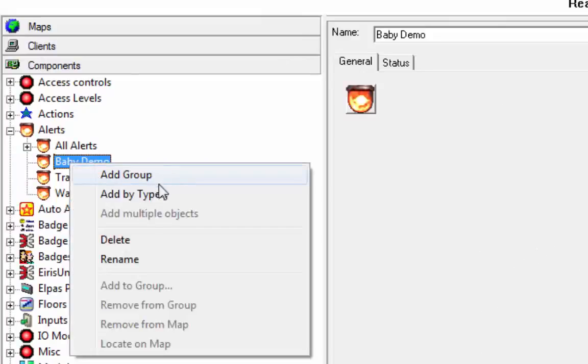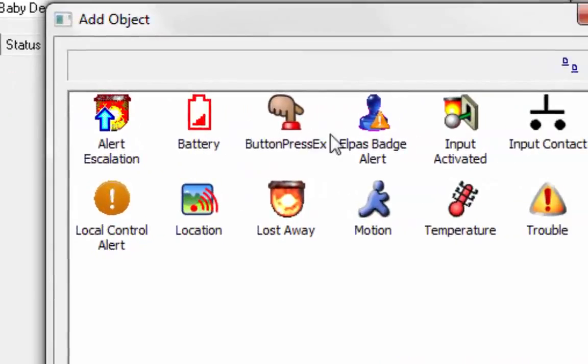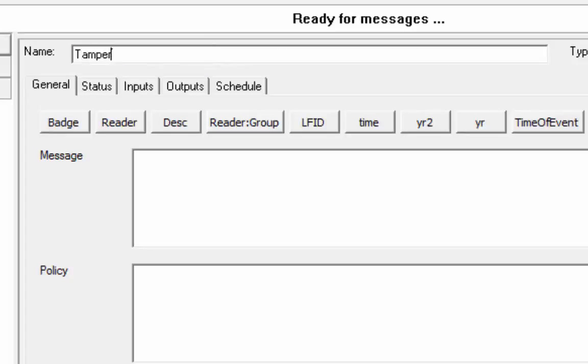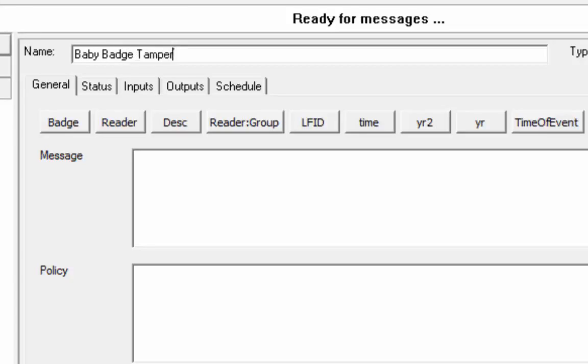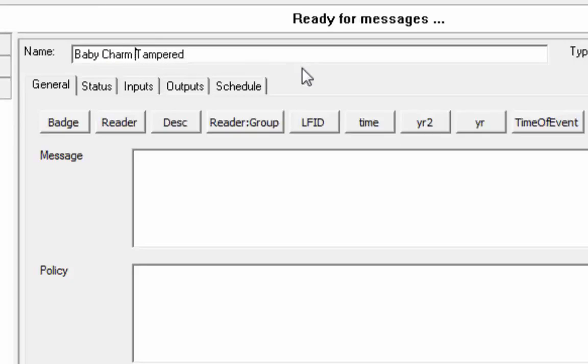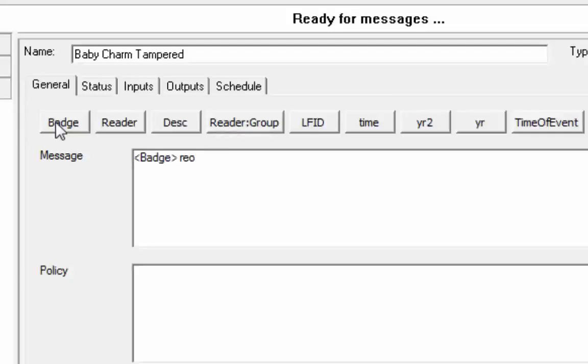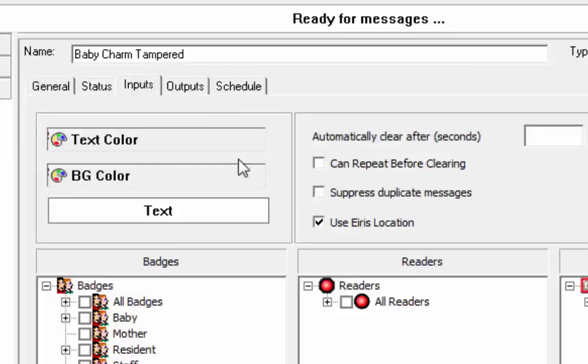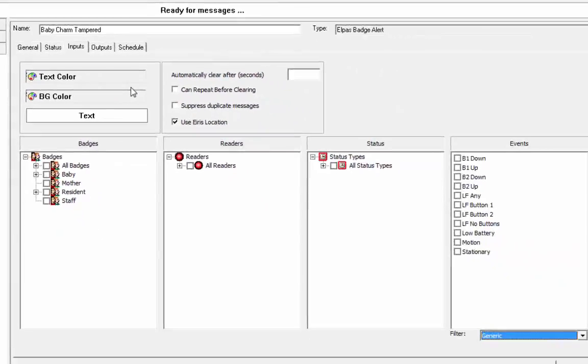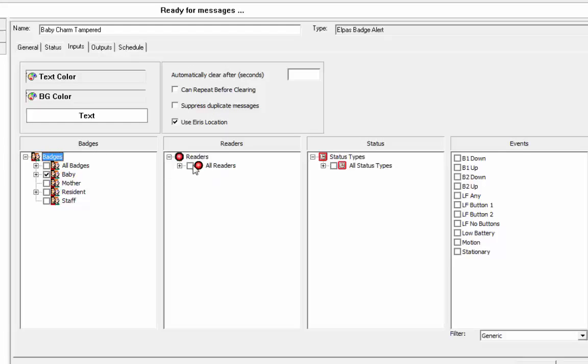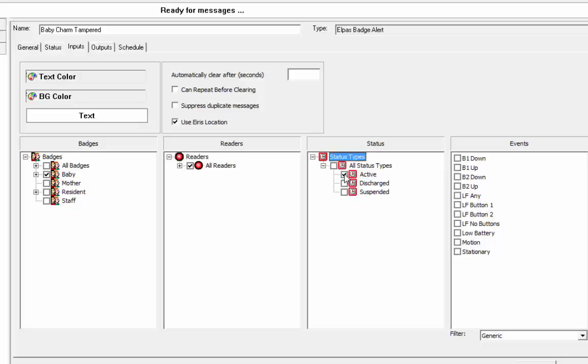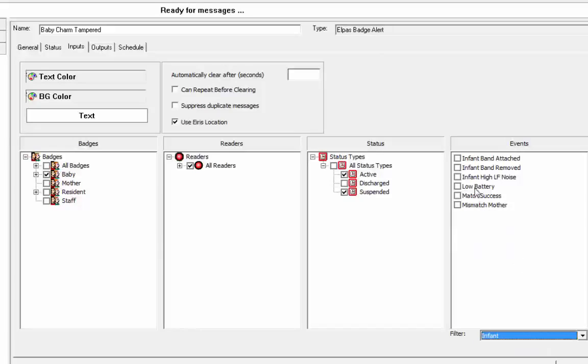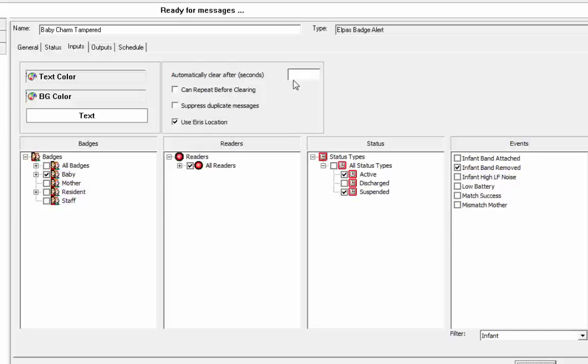So for the baby, we're going to add, define an ELPAS badge alert for the tamper. We're going to call it baby charm tamper. And the message is going to be badge removed at reader. So now that's our message. At the inputs, the criteria of the alert, we're going to say if it's a baby badge of the baby group, any reader, and the status types are going to be for active and suspended, not for discharge, because if we change the status of discharge, then we are able to, it's essentially disarming the band. And the event type, we're going to go to infant and say infant band removed.